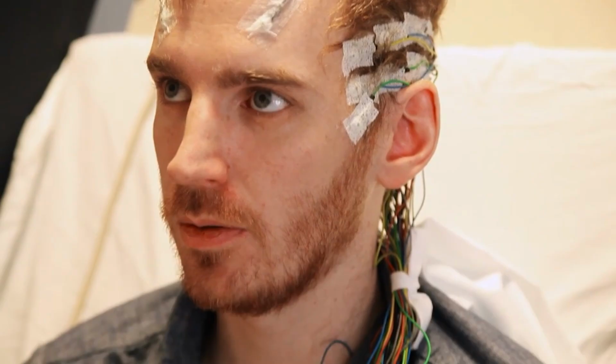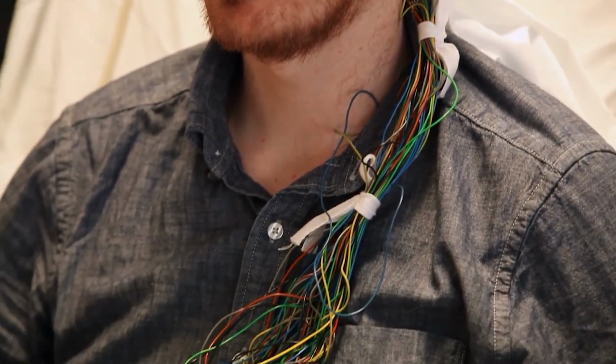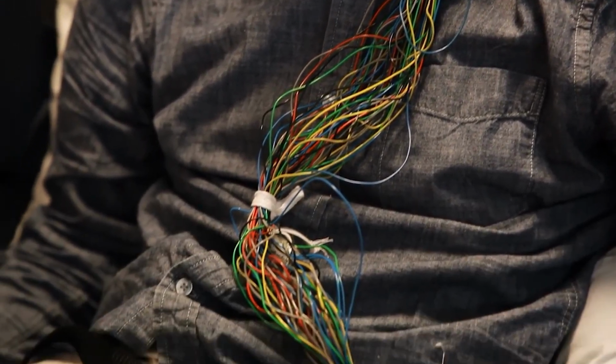We ask patients to push that button as soon as they feel something similar to their seizure activity. We also ask that any visitors, guests, family members that are familiar with the patient and their seizures, push the button as well if they start to see a seizure coming on.